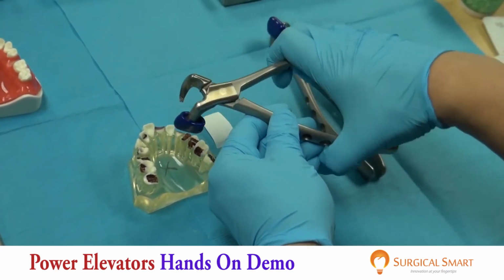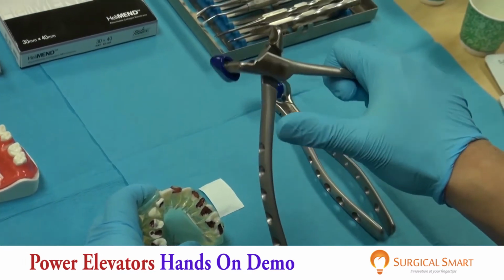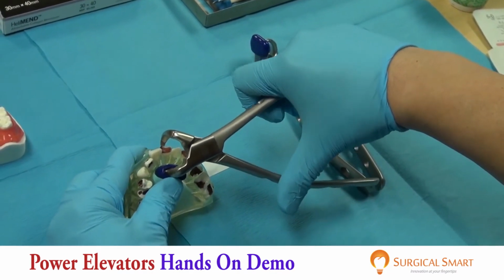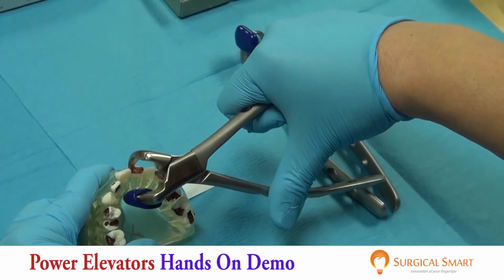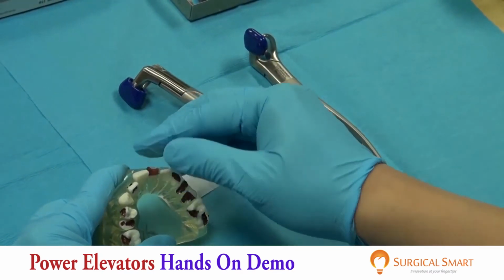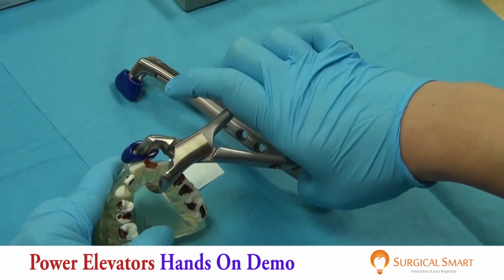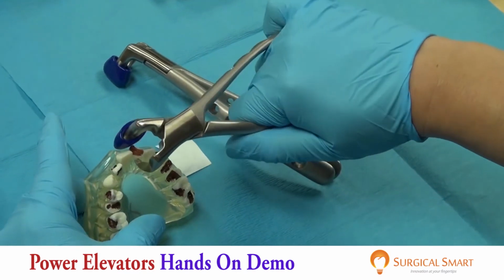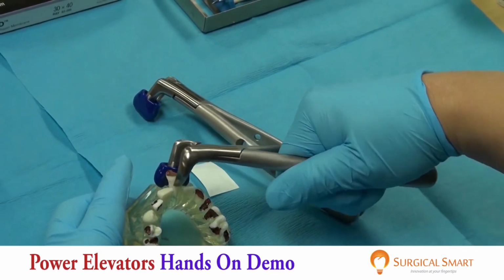There's no squeezing action as if you were grabbing a standard forceps. You hold the bumper end, you place it against the palatal area or the fulcrum, and you simply engage the tooth and you roll it. It's a wrist action. It's no squeezing. It's a wrist action where you just lift it and the tooth comes out. On the other hand, you can also apply it labially. You grab the bumper, okay? And watch my fingers. I'm just stabilizing with my pinky. You can lift it this way.